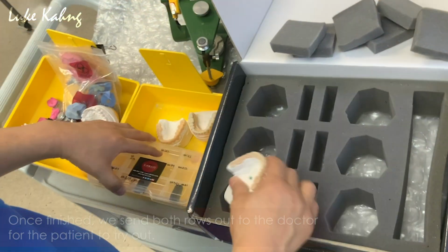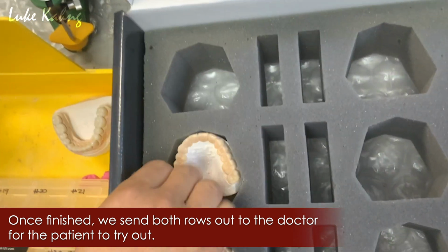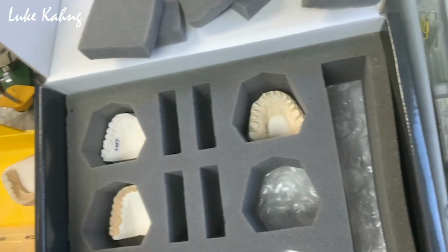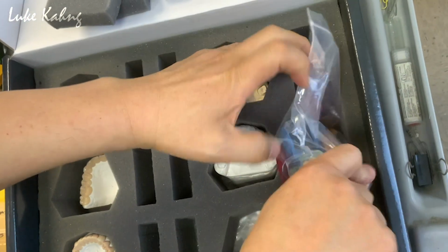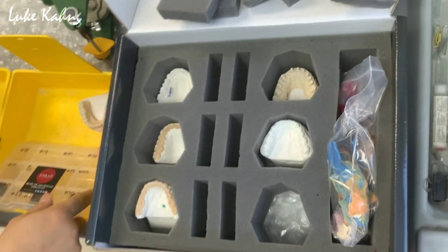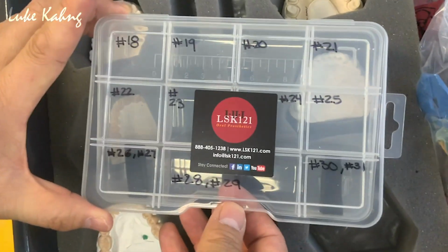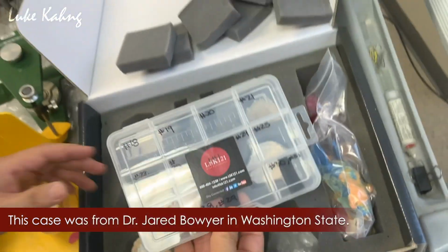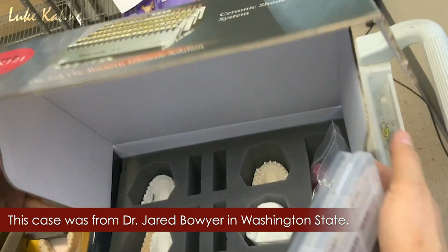Alright, this one is our special full mouth case ready for the dentist. So we just put it in there to make our jobs much easier. You see all these kinds of things put together. Then, especially this one too, so we can put down the number. So we can put the individual number over there. So after this, we can send it to the doctor as well. All right, and then after that, we can seal it.